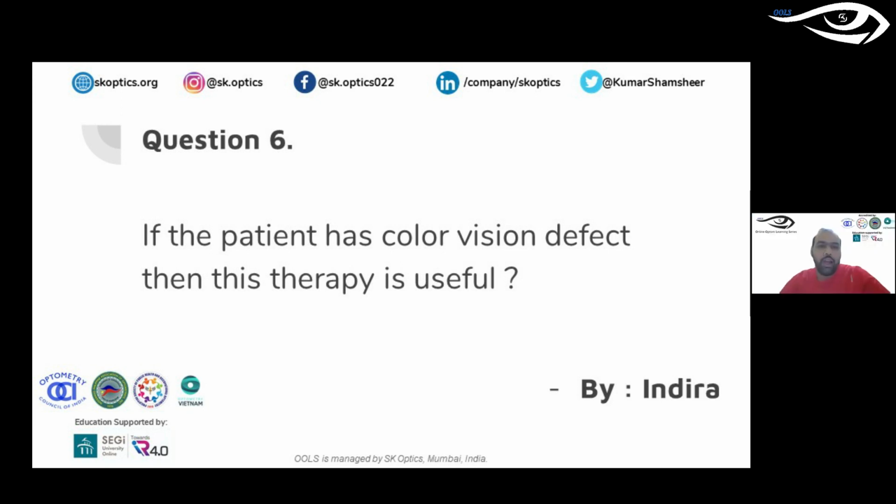Okay. So what I understand about this particular aspect of vision therapy when it comes to computer-based therapy, or Binocs in particular, is that we need to have bifoveal fixation by whatever means. If they have strabismus, try to get bifoveal fixation first by giving them prisms, and then go ahead with vision therapy.